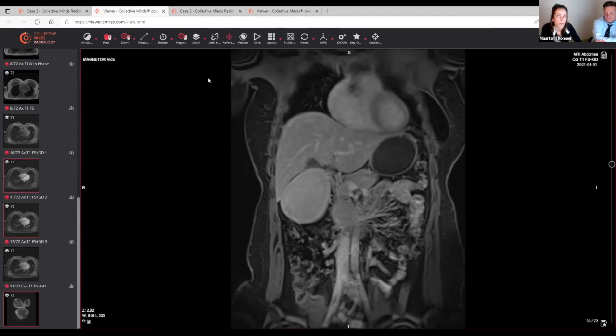Yeah, I performed a biopsy 1 week ago with a colleague, also of an adenoma, and we did also not biopsy a particular part of the lesion. So that's an interesting finding that Maarten told us about. But I also used the ultrasound, and a combination of ultrasound and CT maybe sometimes. Yeah, sometimes if a lesion is hard to visualize, we perform it with CT and ultrasound together, but never with MRI.